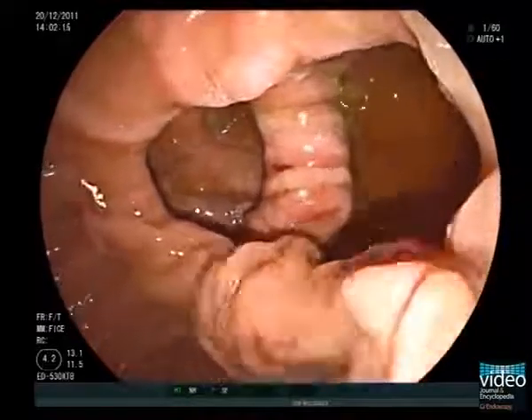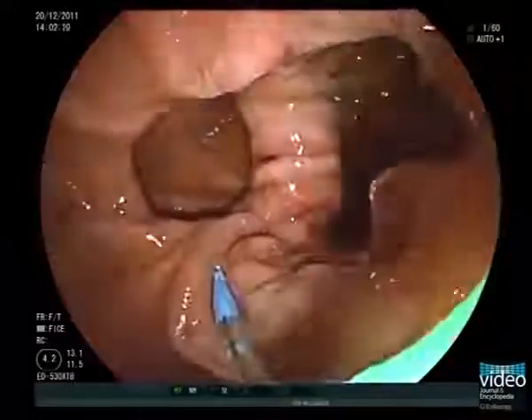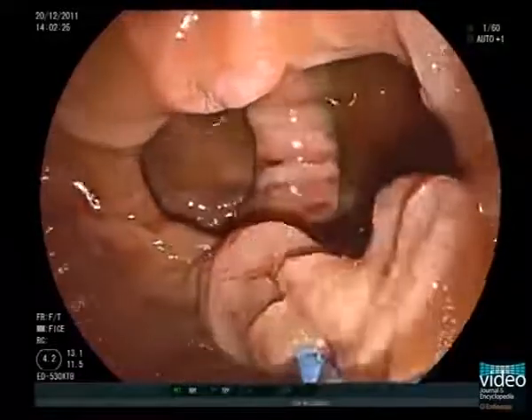We evert and straighten the folds within the diverticular sac by placing traction outside the edge with a cannula. During this maneuver, we always keep an eye on the lower rim of the diverticula to localize the papilla within the folds.